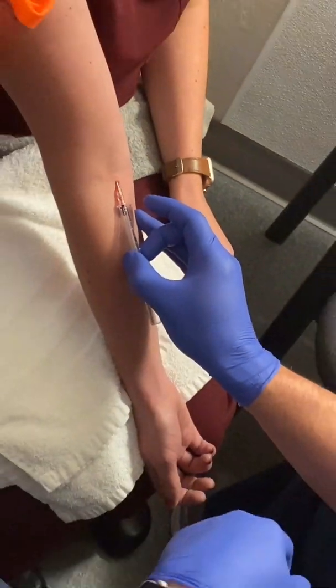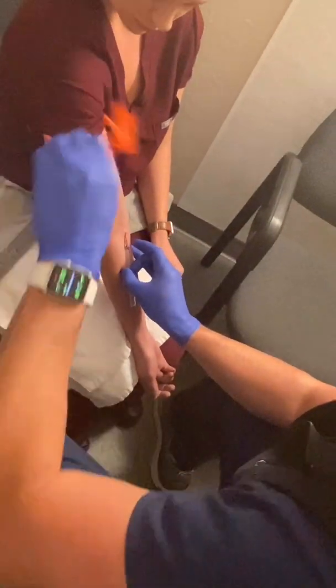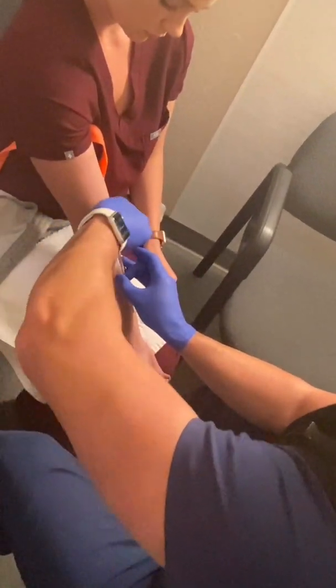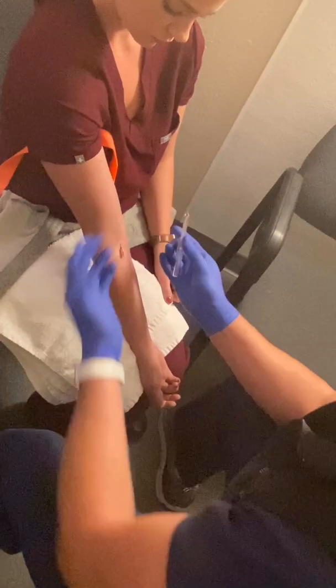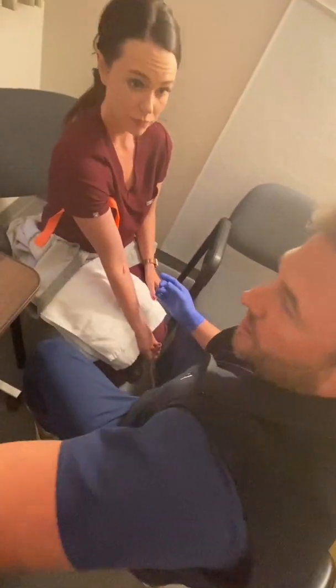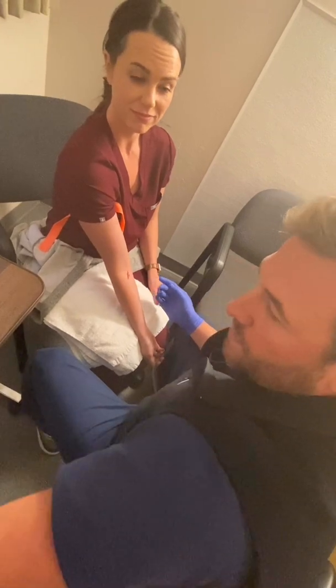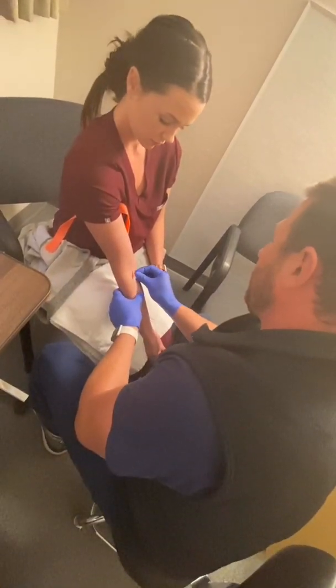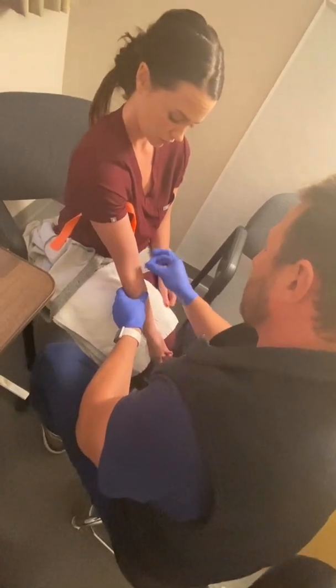These have valves in here, so you won't have any blood coming out, and I don't have to apply pressure above it. So I can just pinch and pull. And you can see here, there's no blood coming out because it has a valve. Housekeeping. Once you do that, it's okay to clean up the side underneath it.